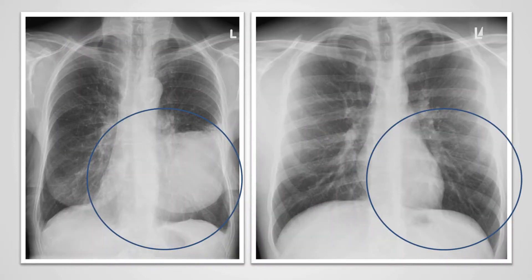Here we have an example of a silhouette sign. On the right, we can identify the heart centrally. We can see the right heart border and the left heart border clearly. On the left hand image, we can see the right heart border, but we cannot identify the left heart border.